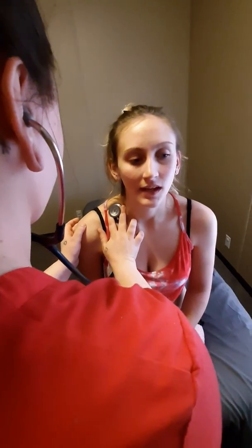Next, I'm going to auscultate for lung sounds, which would be the same areas that I palpated and percussed. And you make sure that you switch to the diaphragm for this. I'm just going to have you breathe in and then breathe out, normal breath.